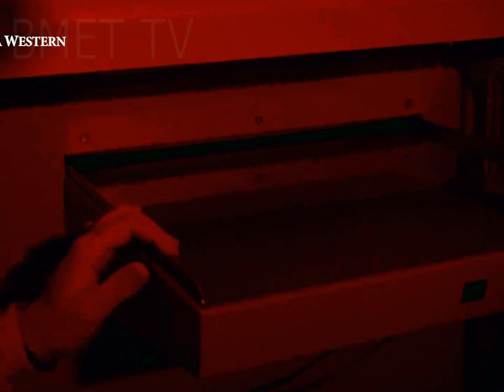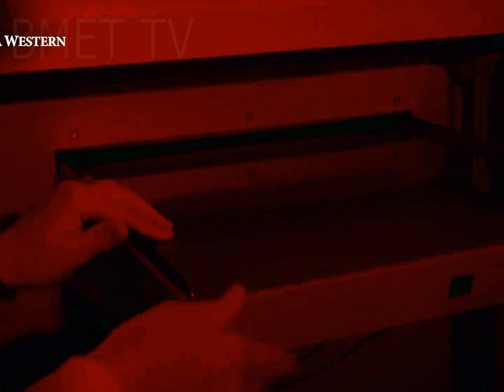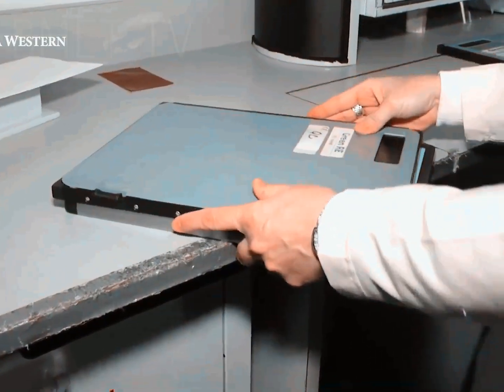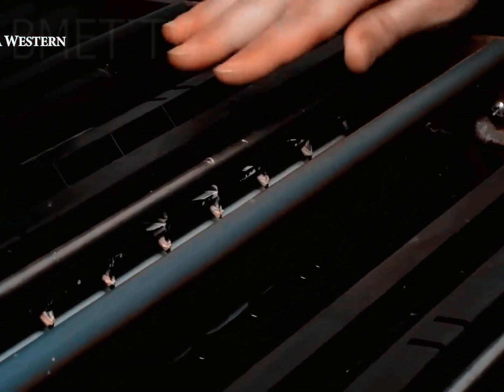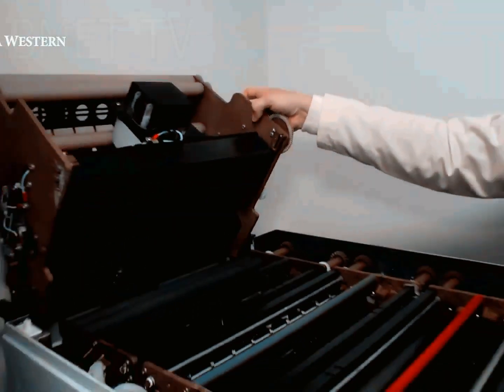X-ray film displays the radiographic image and consists of an emulsion, single or double, of silver halide, of which silver bromide is the most common. When exposed to light, it produces a silver ion and an electron. The electrons get attached to the sensitivity specks and attract the silver ions. Subsequently, the silver ions attach and clumps of metallic silver black are formed. The silver can be reclaimed from an old X-ray film in a process known as silver recovery.